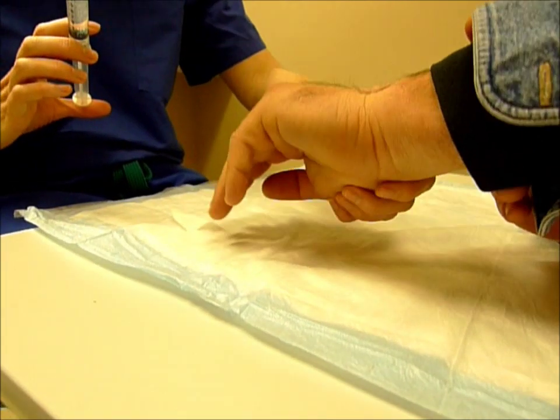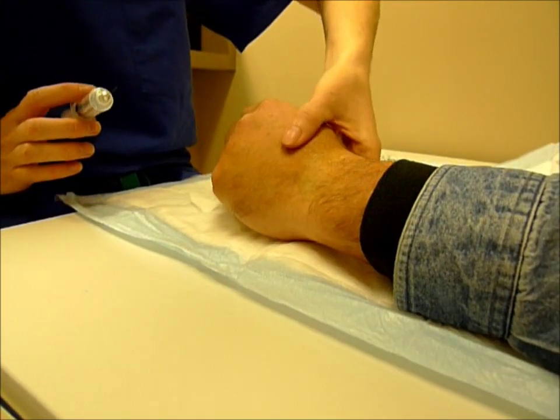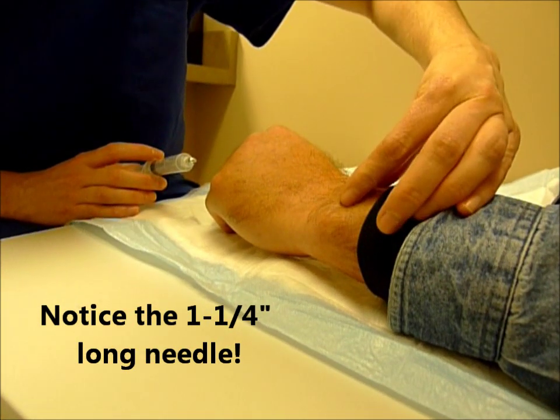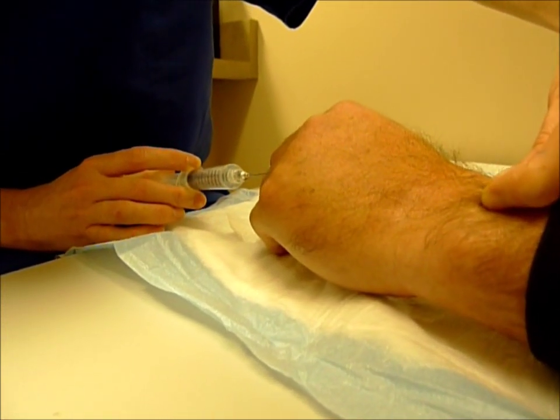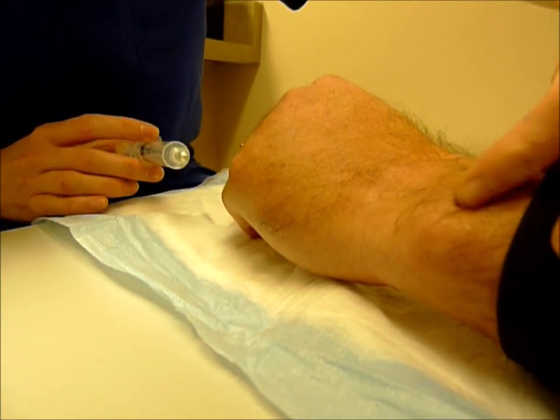I'm going to have you relax your hand this way. I'm going to pinch you up here, and first I'm going to put a little bit in the skin so everything subsequently hopefully doesn't hurt as much — just a little bit in the skin. Good job. And I don't want you to hold your breath.